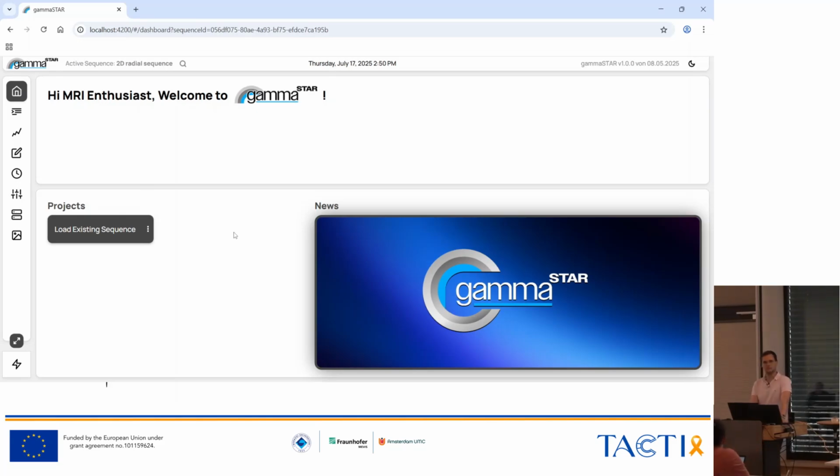So who knows Docker? Okay. It's basically 4 different systems that are containerized so that we can deploy the installation as we have it on our system. It's a standardized way to deploy different systems. Each of these Docker containers is, I think, a Linux system with a specific installation, specific software, and then of course our software installed on top of that.